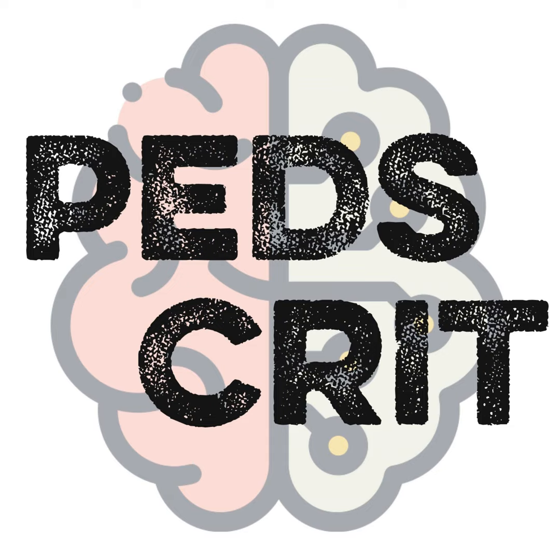So at least if you place an IV, you can wrap it and pack it and all sorts of other stuff, or hold your anticoagulation for a minute. So bleeding is kind of one of the primary things you worry about.